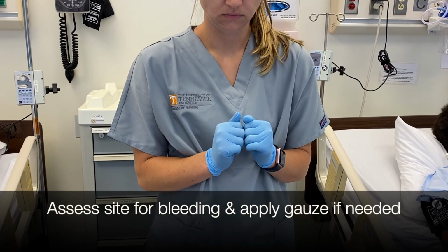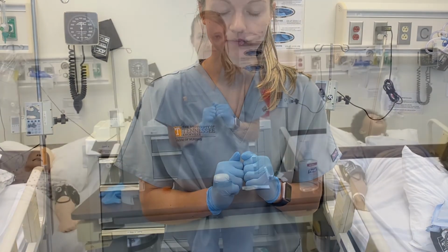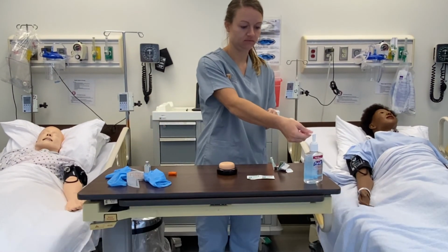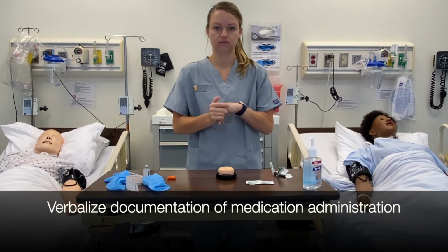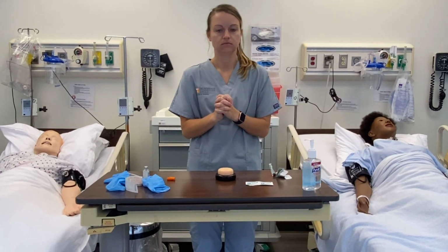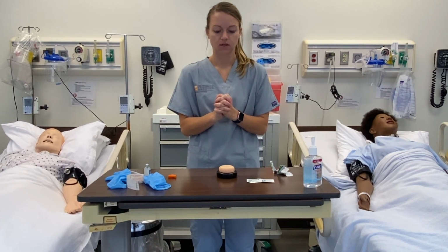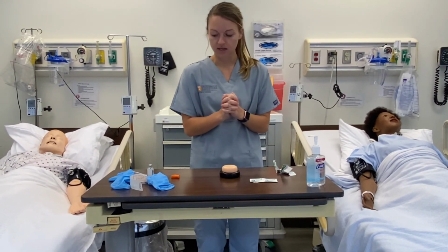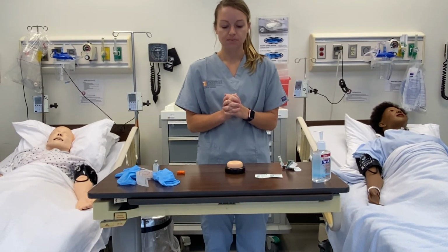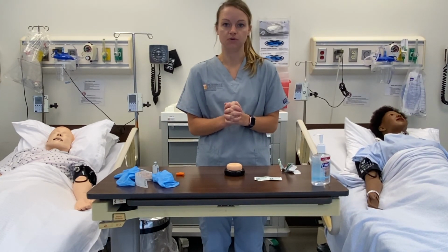Assess site for bleeding and apply gauze gently if needed. The site is not bleeding, so it does not need any gauze. Remove gloves and perform hand hygiene. Verbalize documentation of medication administration, including site, amount of medication given, time, which medication was administered, and evaluation of patient's response. So I will document that I gave Ms. Susan her NPH insulin, that I gave 10 units in the back of her right arm, SubQ now, and that the patient tolerated it well, and I will check her glucose to see if it helped.